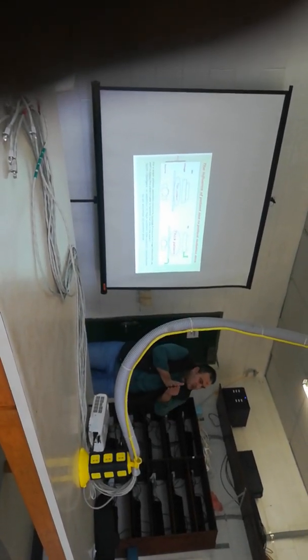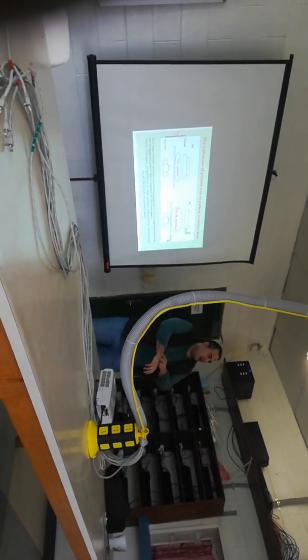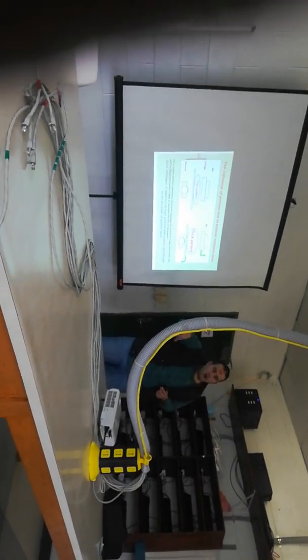And if we expose a small area of the patient like a leg or hand, there is no need to expose all parts of the patient. It's only the organ that you have to expose.